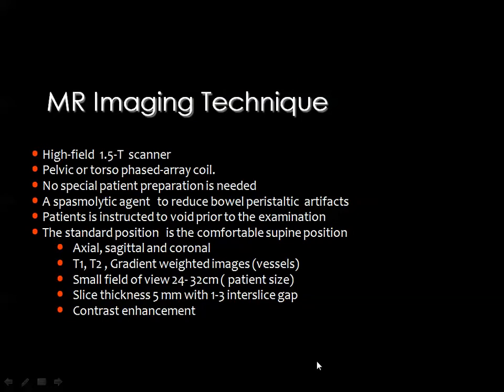Then MRI is, of course, considered one of the most important imaging techniques for evaluation of the female pelvis nowadays, in particular the uterus, and whenever you are going to stage some of the neoplastic lesions, as we will see.